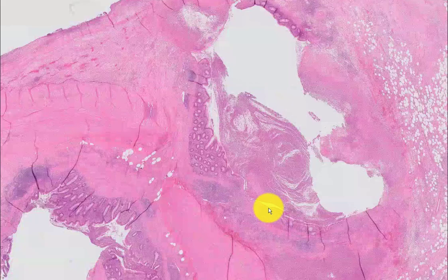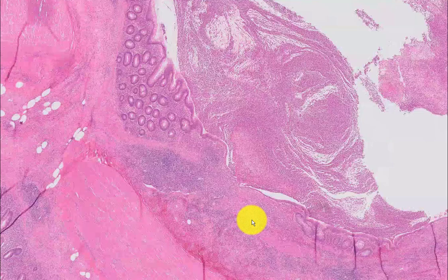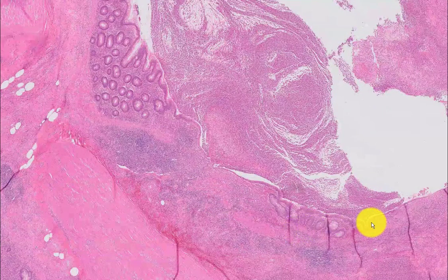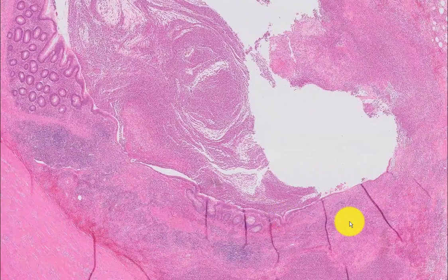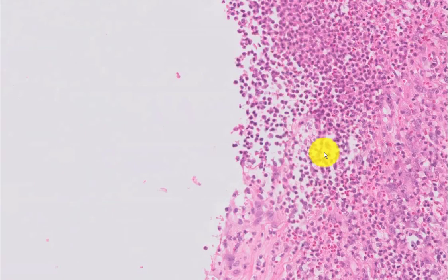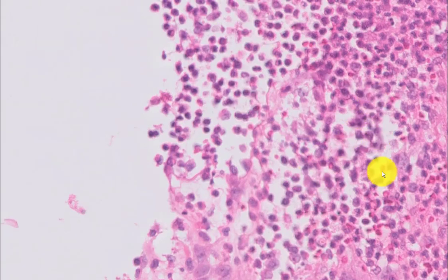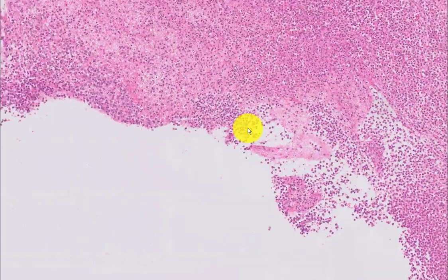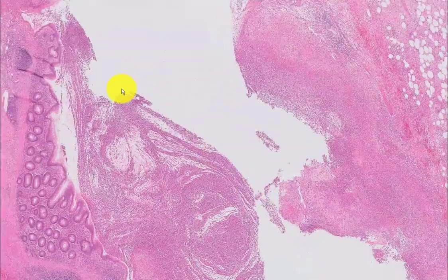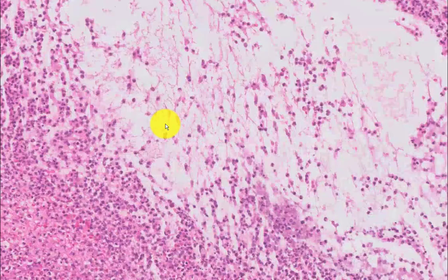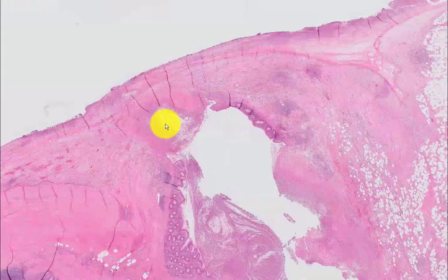This is the diverticulum of the appendix. What is fascinating is that the mucosal lining of the diverticulum shows exactly the same changes as the mucosal lining of the native appendix. It goes a step further, because you'll see that there are sheets of neutrophils lining this ulcerated diverticulum. And that mucin is actually being produced by the diverticulum — this is not a low-grade mucinous neoplasm.